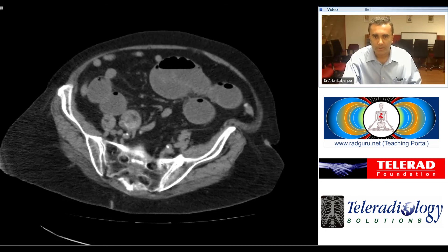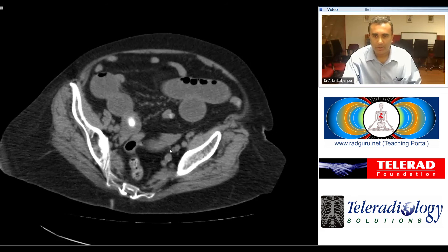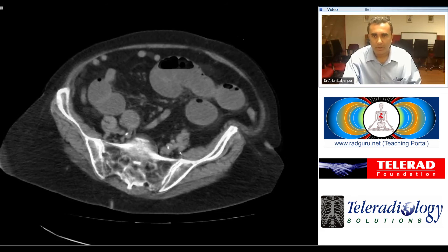The typical site is about two feet from the ileocecal valve, which is the narrowest point of the ileum, and the impaction of the stone at this level results in small bowel obstruction.